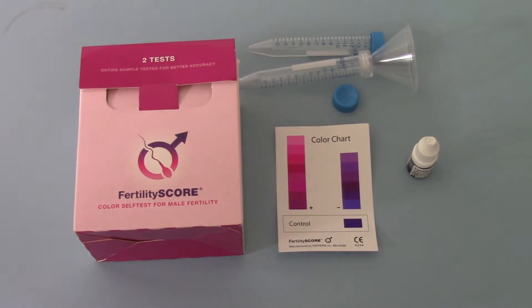In this product video we're going to look in more detail at the FertilityScore 2 Test Male Fertility Testing Kit. This is made by Androscore and distributed in the UK by Access Diagnostics.